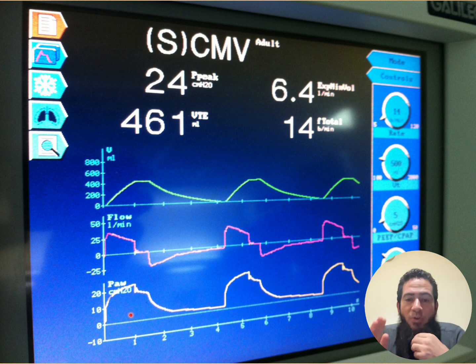If you put him on a normal minute volume, with a breathing rate of only 12 and tidal volume of 500, making a minute volume of just 6 liters, while he was taking more before intubation and ventilation, you are making things worse.